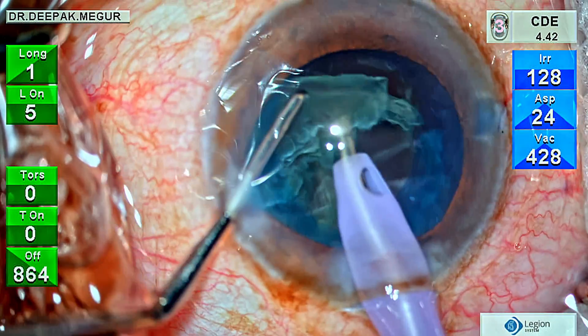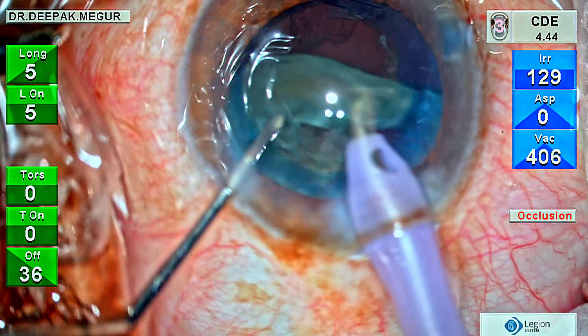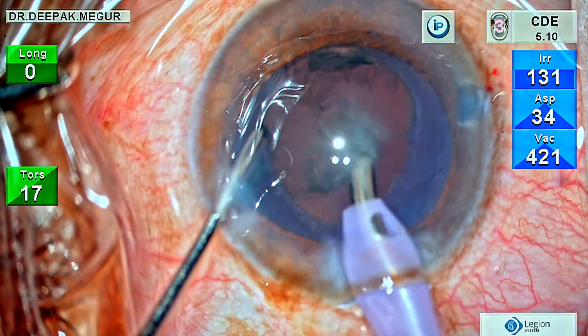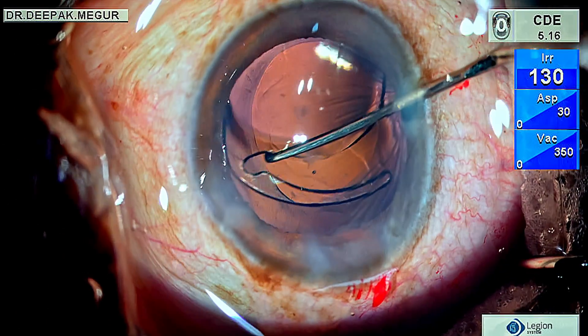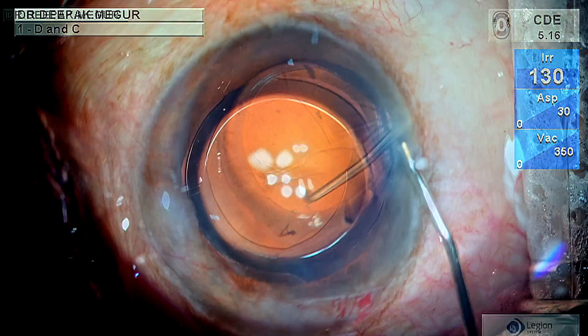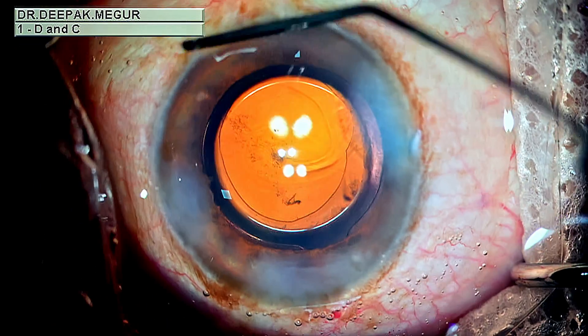Bringing the fragment out of the bag is the key trick — always avoid holding it at the center, because the two peripheral ends of the heminucleus will face resistance from the rhexis, which acts like a barrier. Hold one end and flip it out; it's much easier. In this case, the rhexis had to be slightly bigger, but unfortunately I didn't anticipate a crumbly cortical cataract. These are some of the lessons we learn along the way.